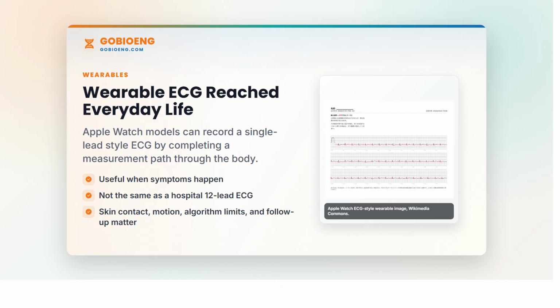AI in ECG is not only a classification problem. Data quality, population bias, false positives, false negatives, explainability, clinical workflow, and responsibility all matter.